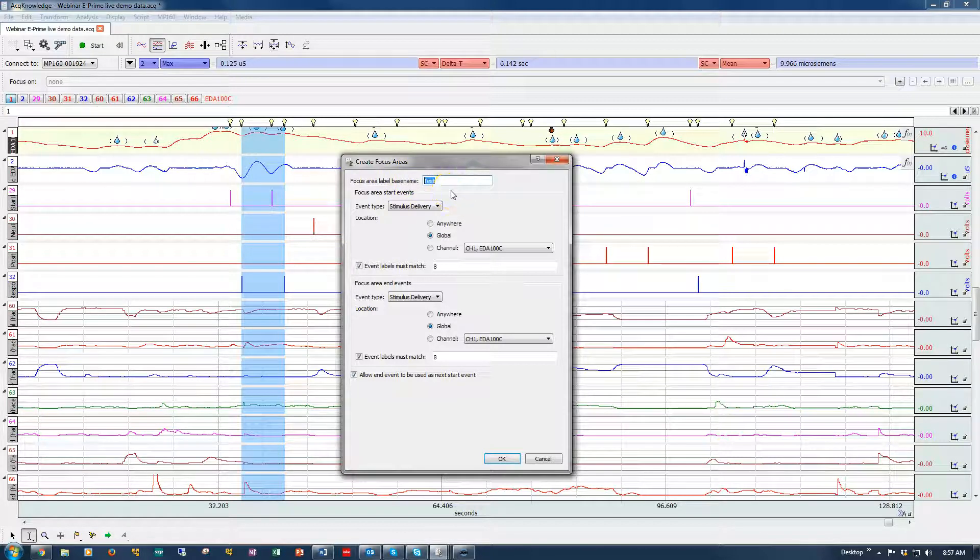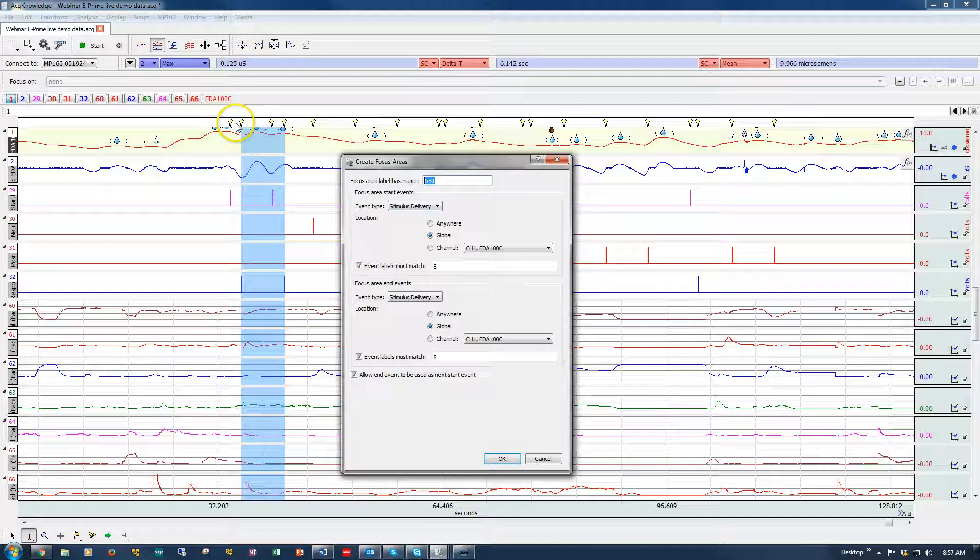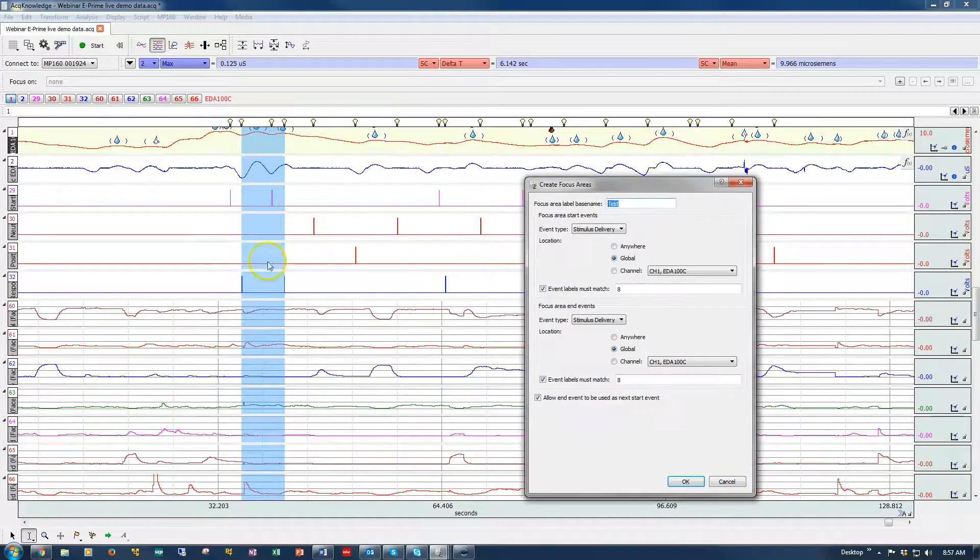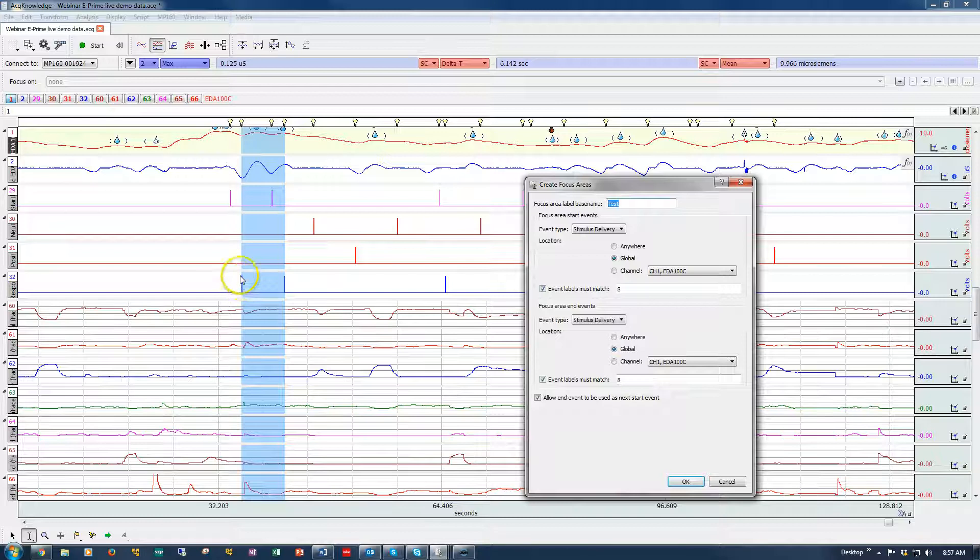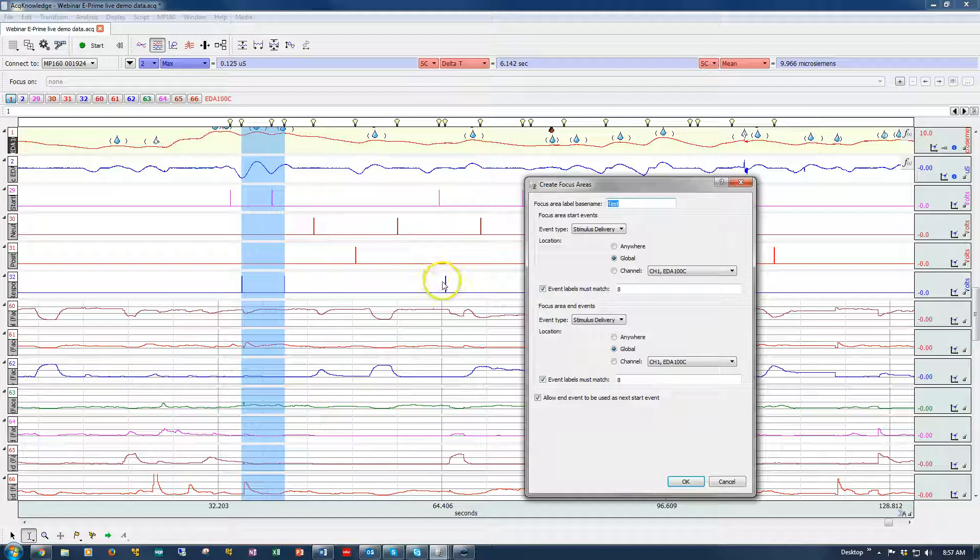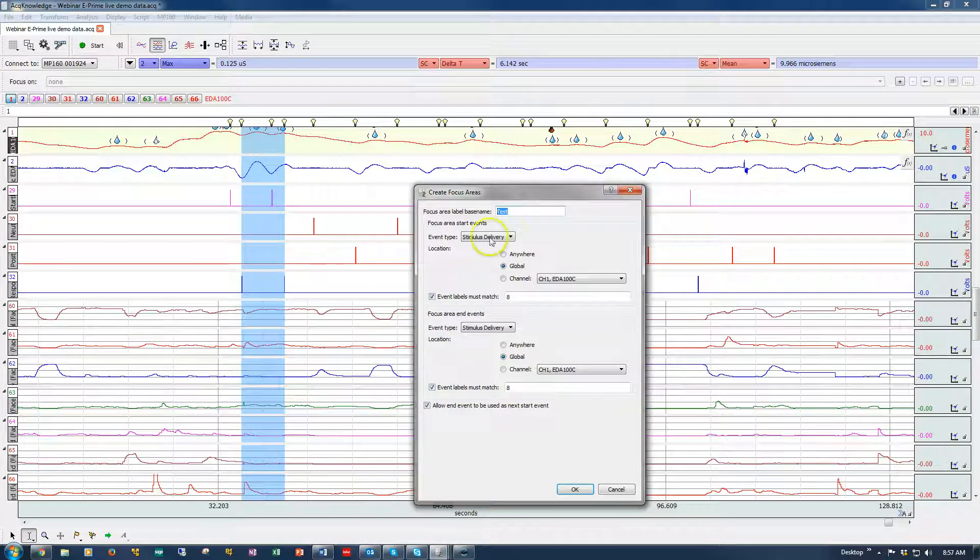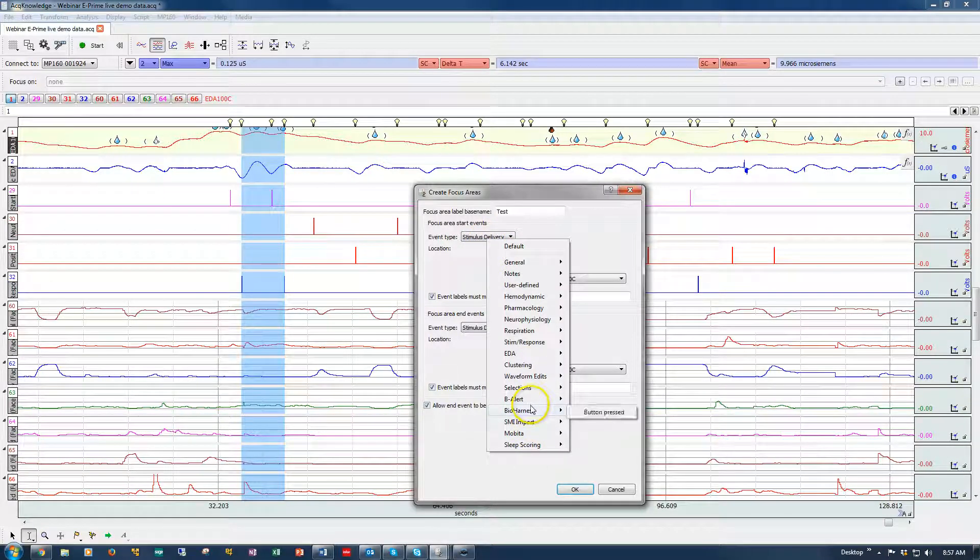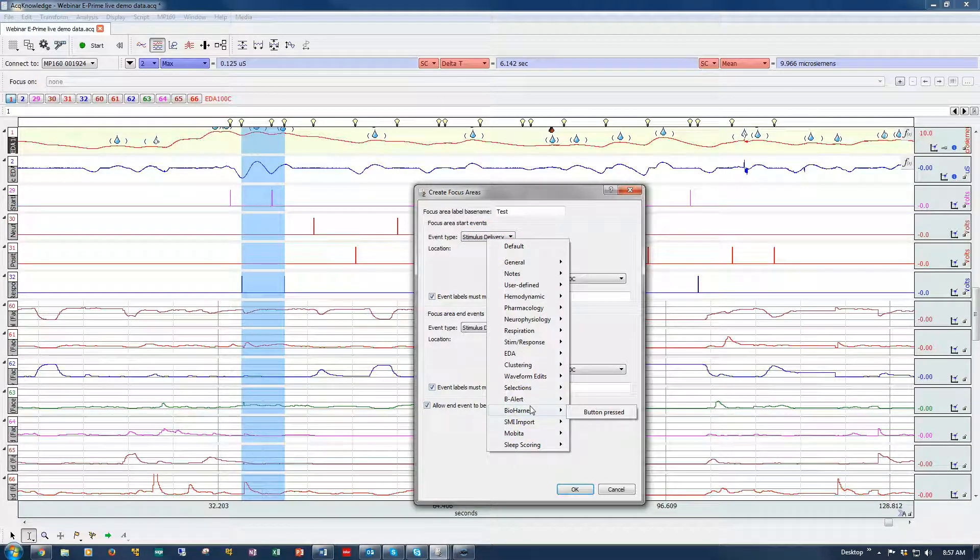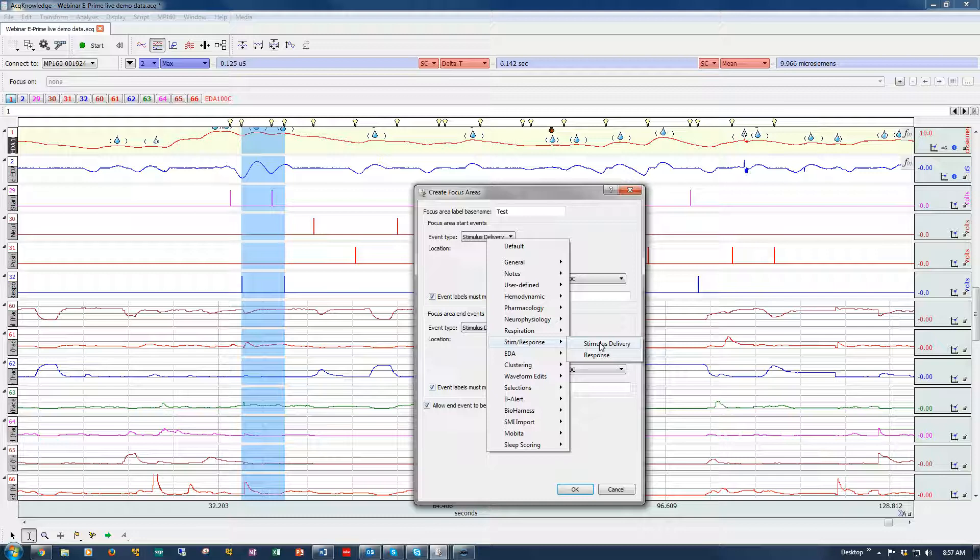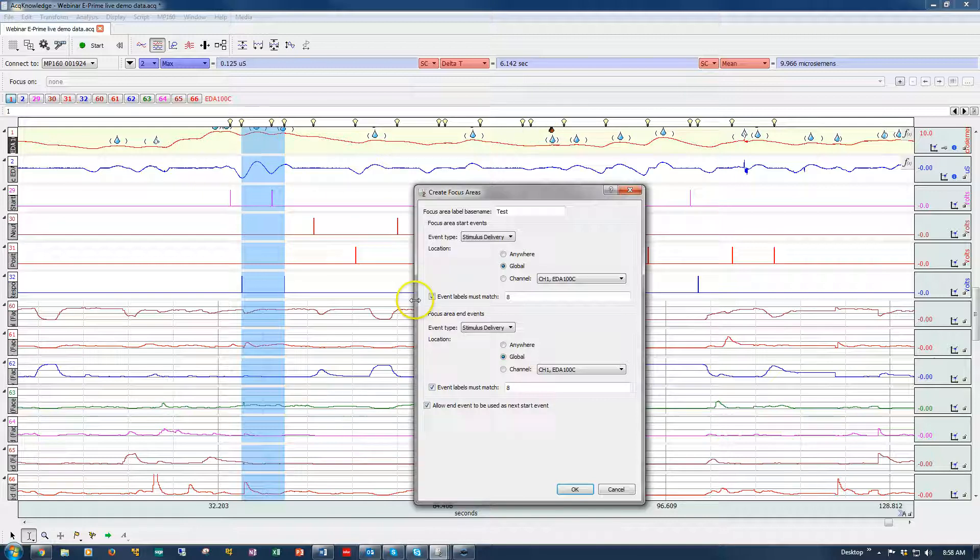First thing you can do is type in a name. I've got one already in here called Test. You then need to identify the type of events that you want to use for the boundaries. Most typically it's going to be stimulus delivery events. These are the yellow light bulbs that come when we convert TTL pulses, digital triggers, coming in from a stimulus presentation.